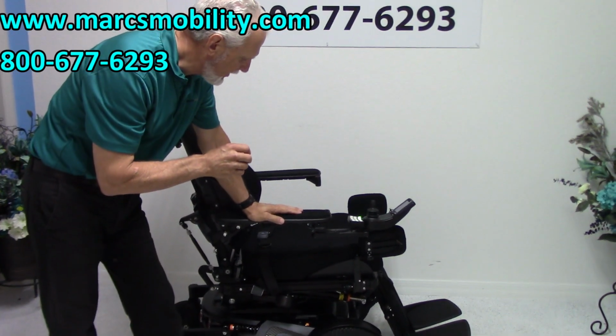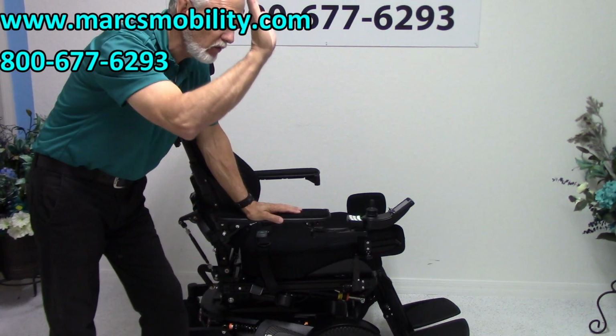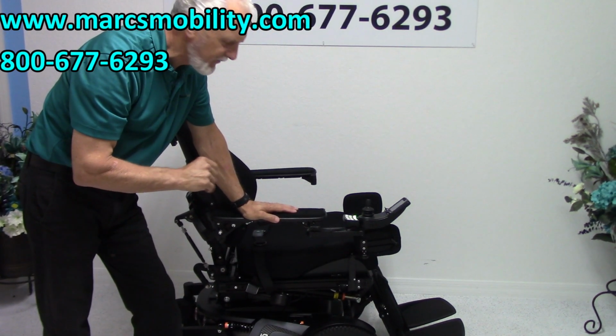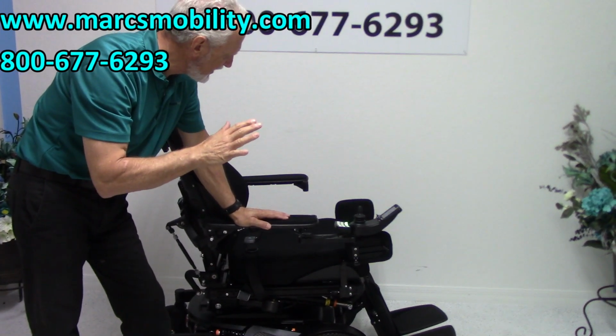This is a Permobil F5 power chair. It's the F5 VS for vertical standing. This power chair has 5 or 6 different positioning that it can do.